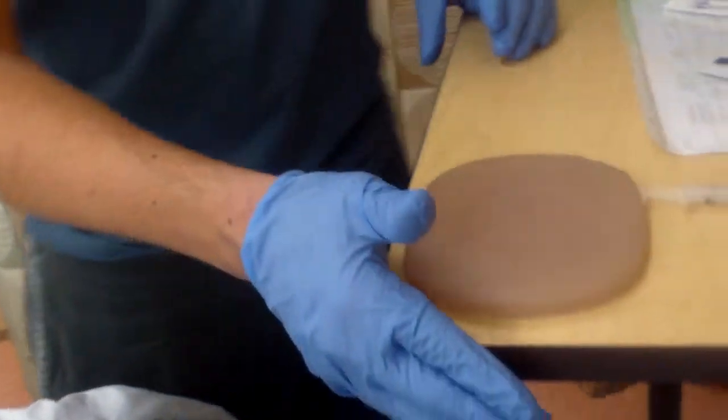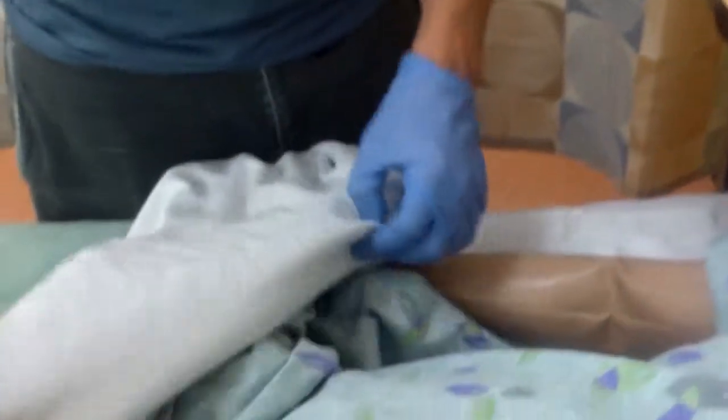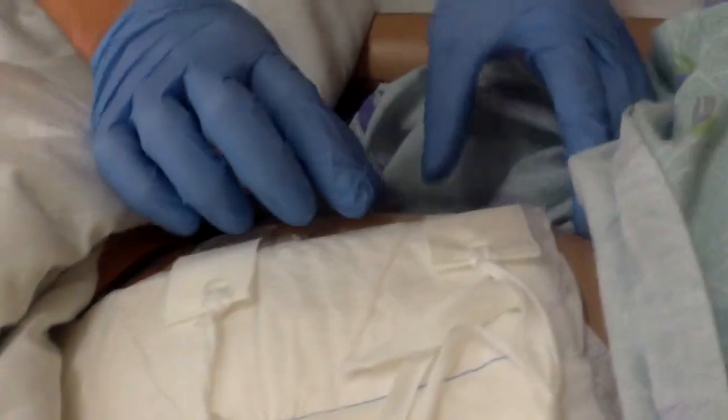Alright, and then for my second medication, I need to do a subcutaneous one. So then, providing for privacy, I know they have an abdominal wound, but I want to go to the side of the wound. So finding this site, I would use 2 inches away from the umbilicus, above the belt line, or in the fatty portion of the medial portion of the abdomen here. I would find that little fatty portion right there. And then I would do the same thing for that.